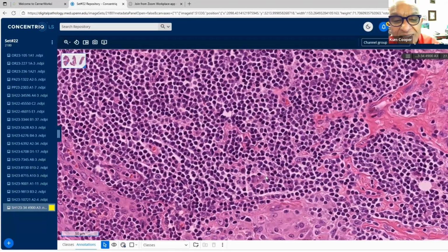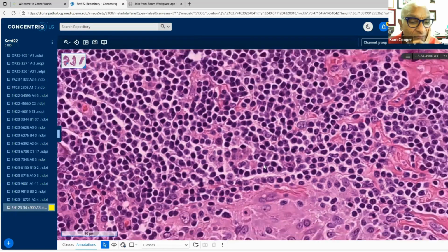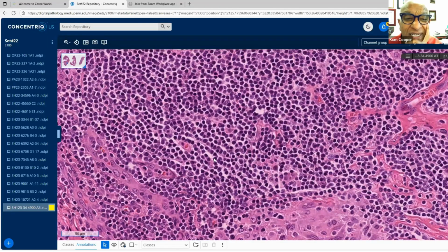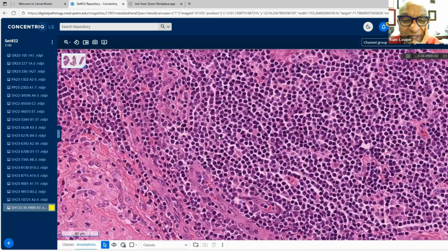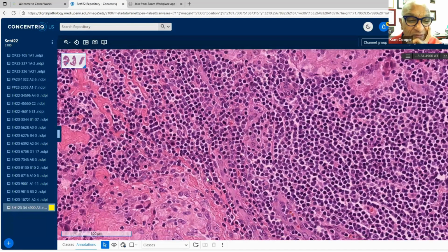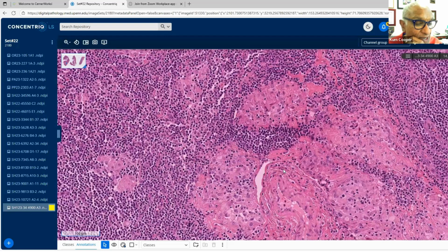Okay, here we go. There's more of these bigger cells. Okay, so a granulomatous lymphadenitis with the intervening lymphoid stroma. There's a nice one here, with these large cells, prominent nuclear membrane, and vesicular chromatin. Okay. Any thoughts? I've got here Hodgkin's lymphoma.